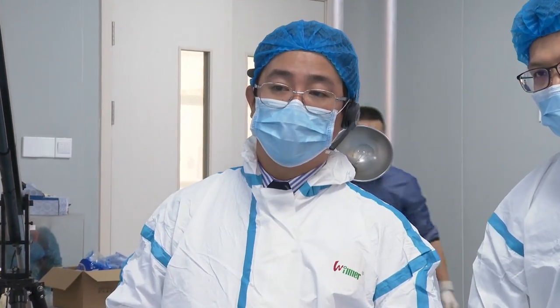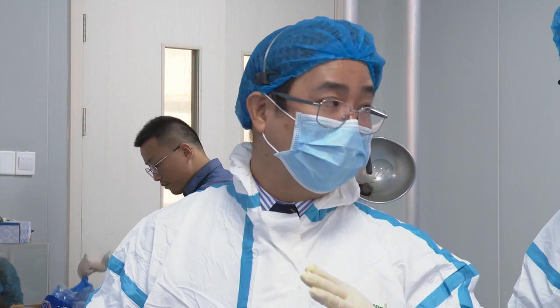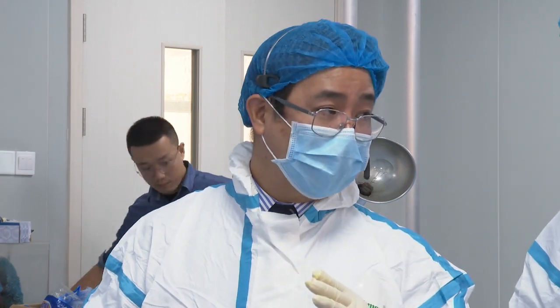That's my point. I want to make my screw eccentric, to push the graft to anteromedial. The benefit is you can get more oblique. You have less impingement to the PCL, and you can get the more anatomic, ribbon concept. Because when you put the screw on one side, the graft will change from round to ribbon, because the screw occupies the space. You got it? Thank you for your comment.